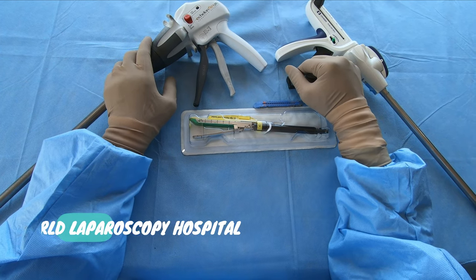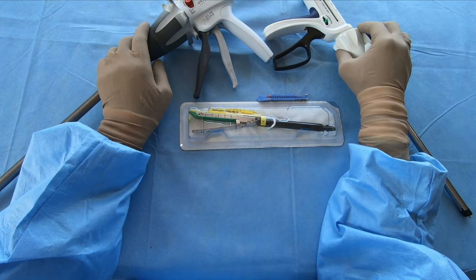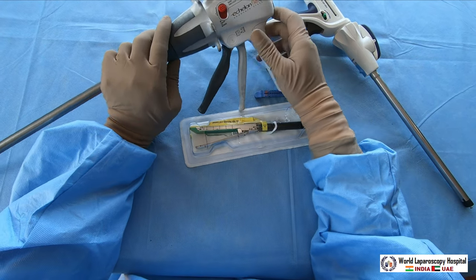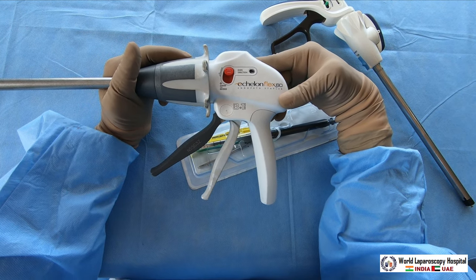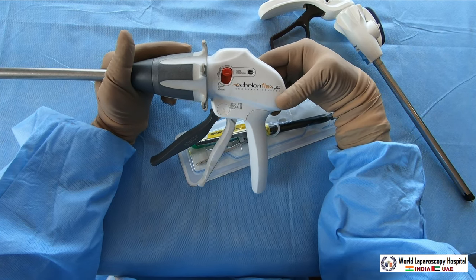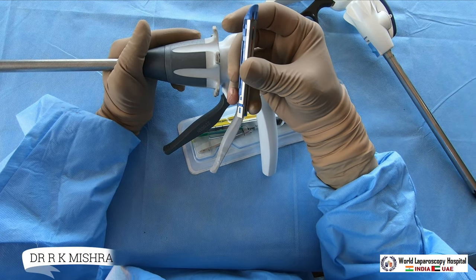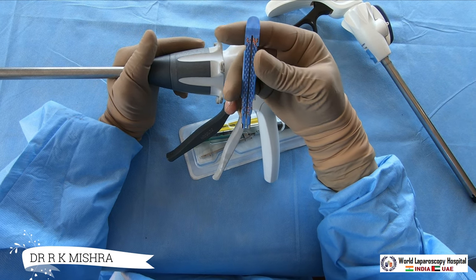Hello friends, today I am going to demonstrate to you two staplers which are very commonly used in laparoscopic surgery. One is the Echelon Flex 60, which is a very popular brand from Ethicon. It has a 60 millimeter cartridge, and there are different colors of cartridge available.